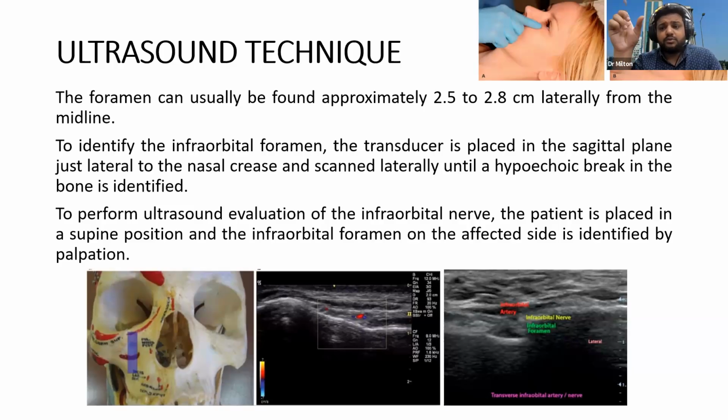Also, there is something you should remember: do not press your probe very tightly. It is better to just touch gently, because there is a very superficial artery. If you apply excess pressure over this area, it collapses the blood circulation.